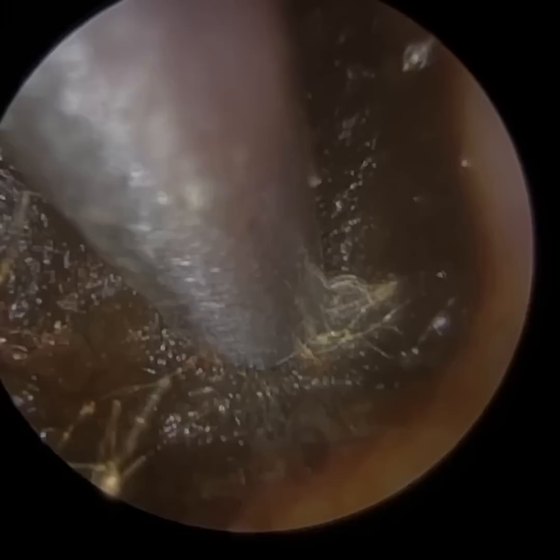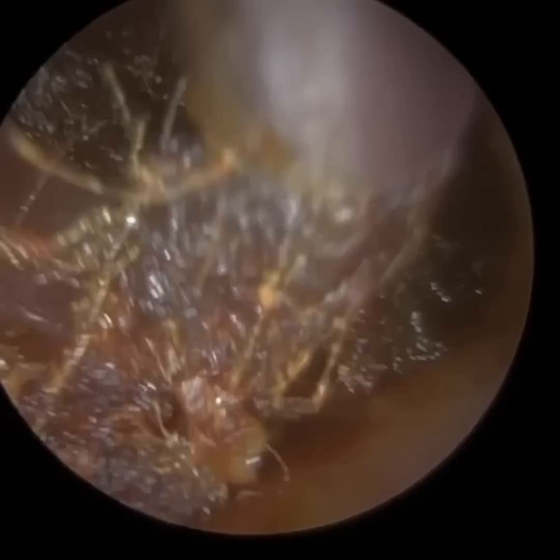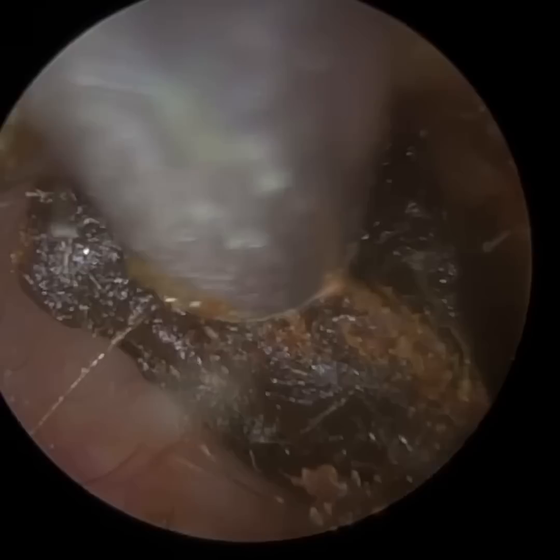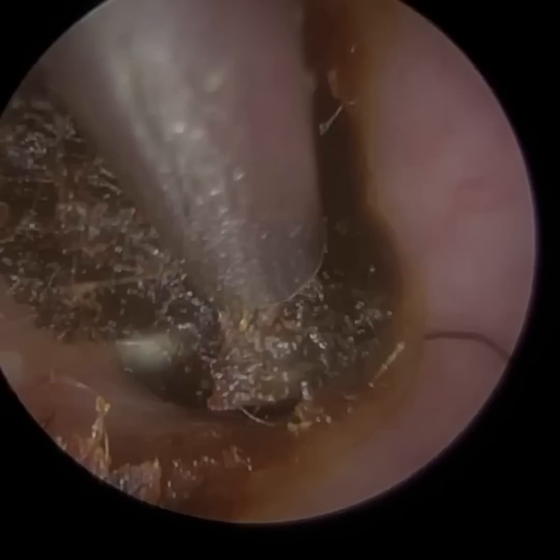I'm just going to be careful with the sucker, because we don't know what's behind this wax — are we right up against the eardrum, or is the bony part of the ear canal sticking out here? So we've just got to be gentle and assess it, just hovering over the surface, trying to break this up gently. There are a few hairs there as well. When you've got hairs this deep in the ear, more often than not, either they're impacted by using cotton buds, or the patient's been trimming their ear hairs and these have been flying into the ear. If you're someone that trims their ear hair, that's fine — just place a little cotton ball at the entrance, you don't have to push it in. It just prevents any loose hairs flying in, because once you've got hairs in your ear, it's very difficult for the wax to naturally migrate and it gets matted.